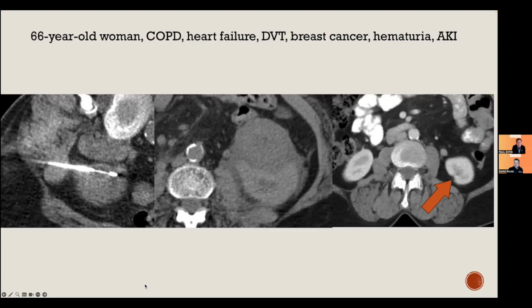So that might not have been the best target area to choose. Also, areas of thin cortex bring you closer to the more central vessels, and maybe that's why this patient developed a large hematoma as shown on the middle image.